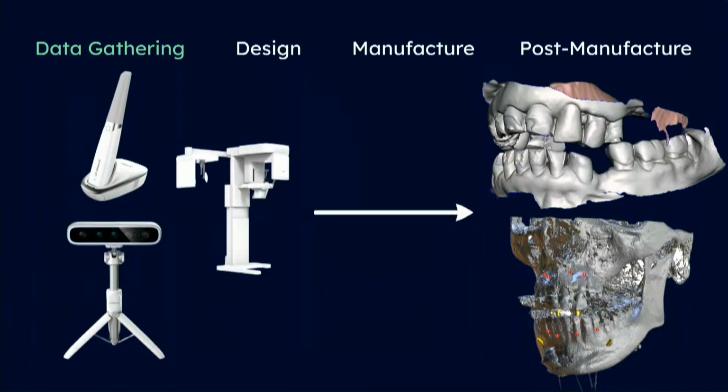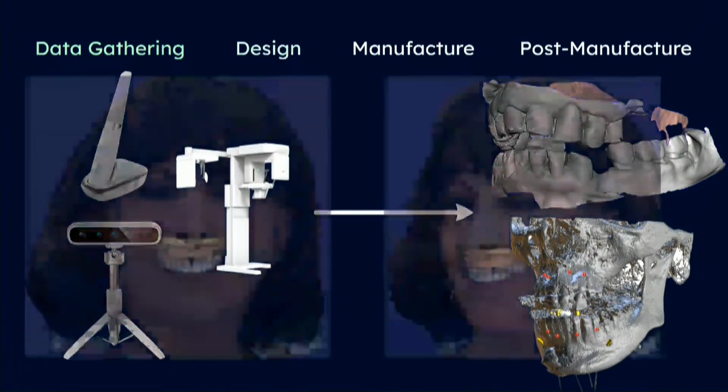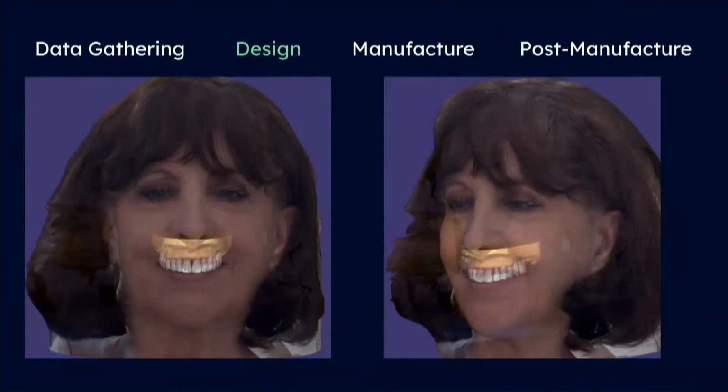So the patient was digitized via intraoral scanning in this case, coupled with CBCT and facial scanning as well. This combination will, as we will see, provide us with the basis needed for a predictable treatment aesthetically and functionally, as the patient was adamant to have fixed treatment in every step of the way. Following virtually edentulating the patient, a digital design of her new occlusal scheme was aesthetically driven by her facial scan.